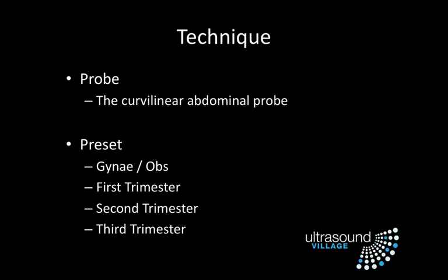We use the curvilinear abdominal probe, and you make sure your preset is right. If you've got a non-pregnant patient, use the gynae preset. If the patient is pregnant, you choose whether you want a first, second or third trimester preset.